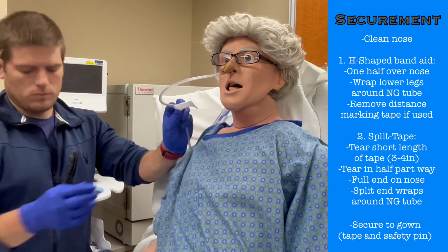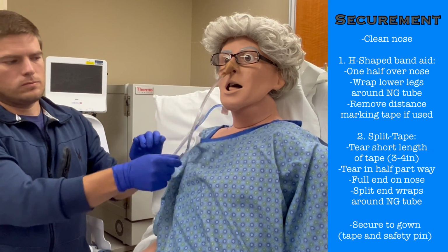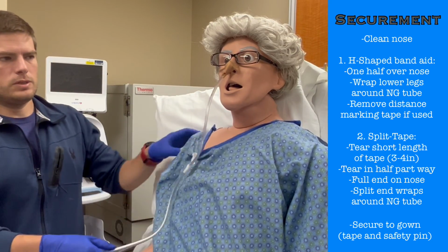Secure this to the gown using the safety pin. Make sure there is some slack between the pin and the nose. This will help prevent the tube from being accidentally pulled out.